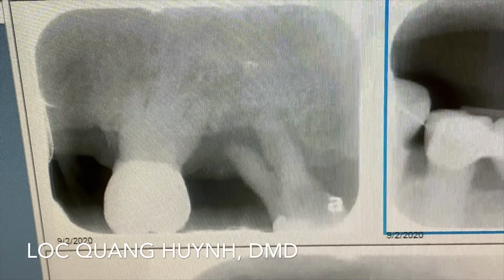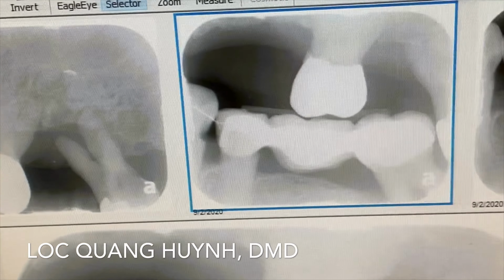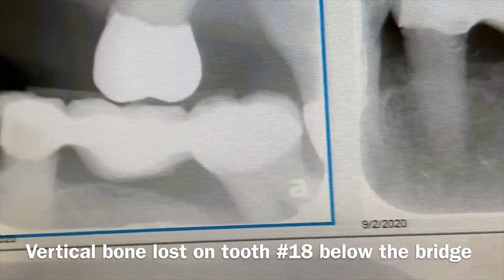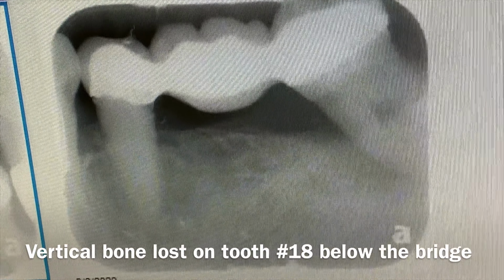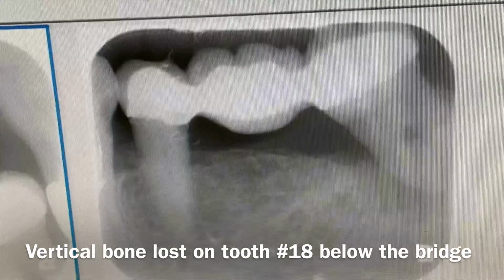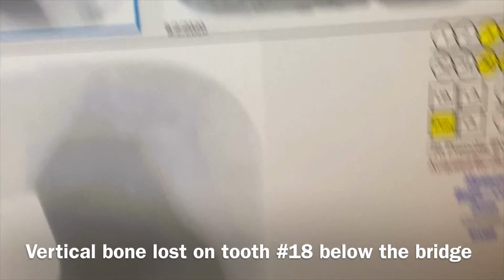convincing your patient. Once you remove it, you're going to see a very dirty tooth underneath, the root on tooth number 16 right there, with bone loss and the root hanging around. And the other tooth is tooth number 18, where you can see the infection, and clinically there's a lot of pus coming out. The patient thinks it's still strong and healthy, but let me show you how the tooth looks after the tooth removal.